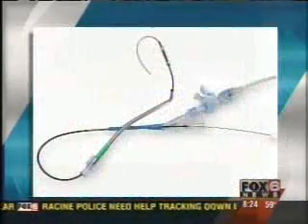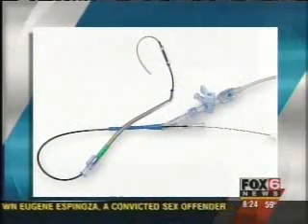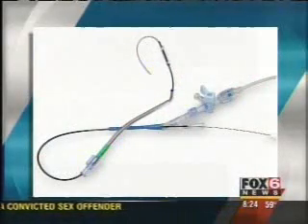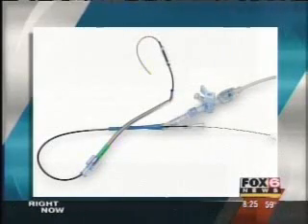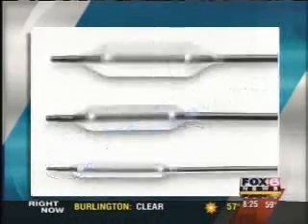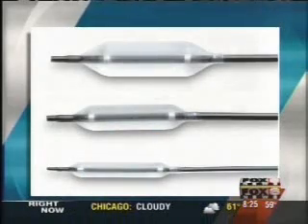And we've got some images also of the tools that you use to do this. Yeah, and that's it. It's really very similar to what is currently used for angioplasty. So same concept in the heart vessels, and exact same thing. The wire and the balloon are shown there, and that's when the balloon is inflated. That's what that's showing. And you're talking about your face, and my concern would be, is there scarring? No, this is the best thing with this, there's no scarring, there's minimal bleeding. It's a very easy recovery, which is a dramatic difference from what we've had available prior to now.